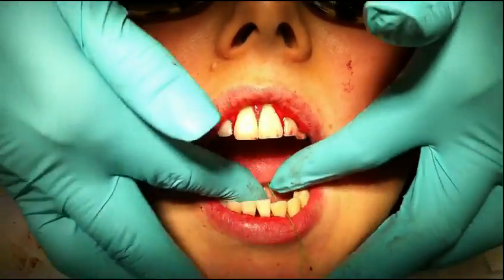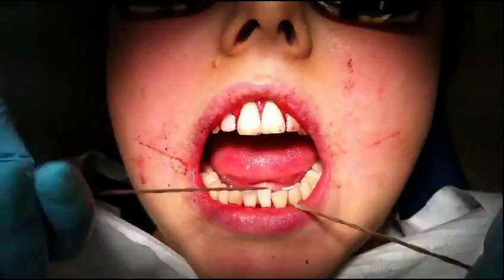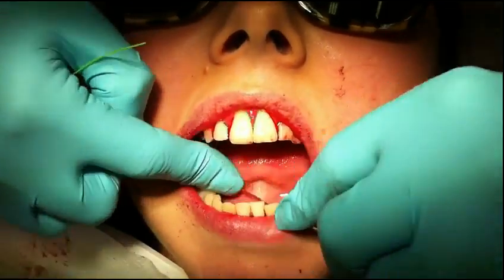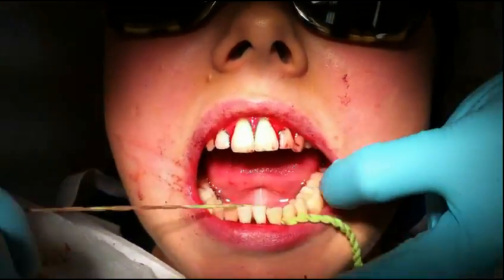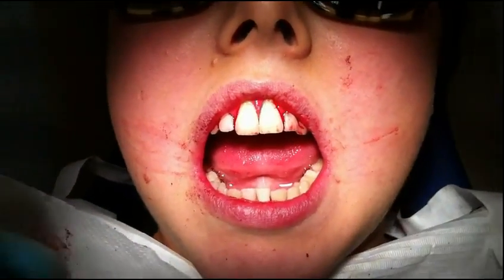Giving the patient both the thick one and the thin one gives them the option to play around with the floss and decide which is best for them. For this area here, I would obviously rather use the X-floss light because it's so much thinner.